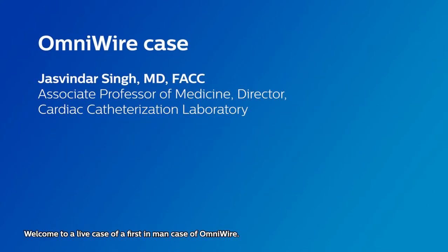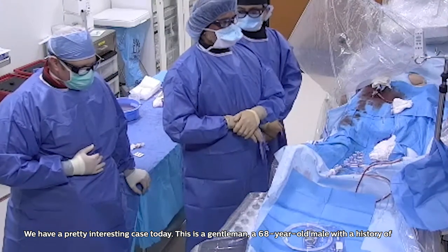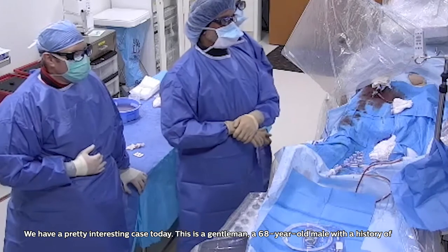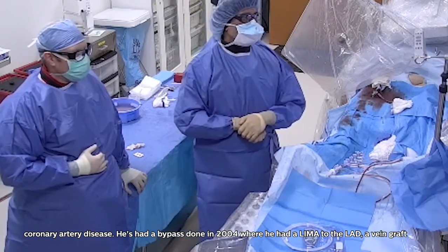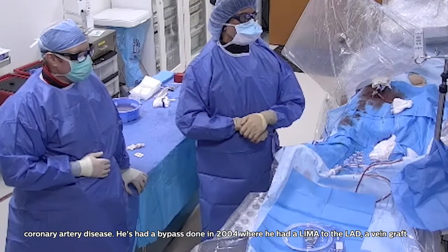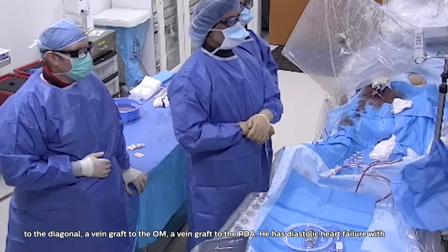Welcome to a live case, our first in man case of Omni Wire. We have a pretty interesting case today. This is a 68-year-old male with a history of coronary artery disease. He's had a bypass done in 2004, where he had a LIMA to the LAD, a vein graft to the diagonal, a vein graft to the OM, a vein graft to the PDA.